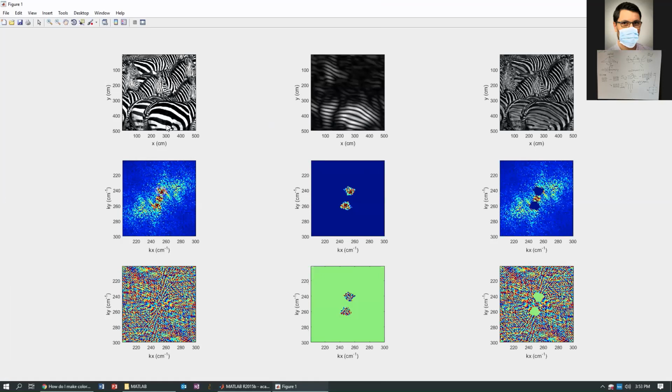So of course I chose the picture with a lot of stripes so that it would have some interesting features in the spectrum. And you can really see by selecting this region of the spectra, now we're really seeing this type of information that's being encoded by the spectrum.